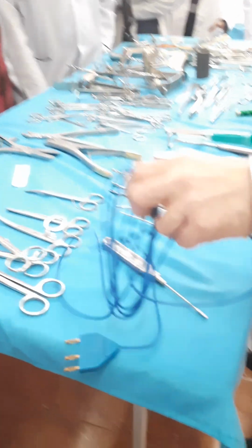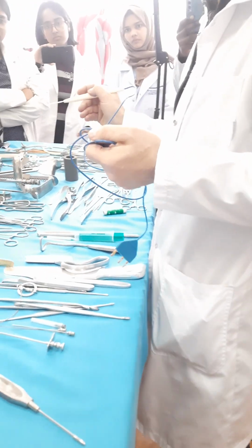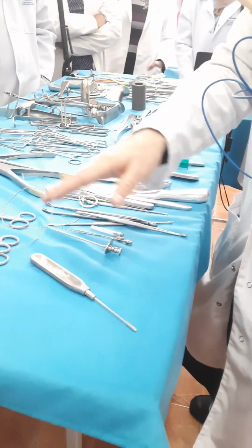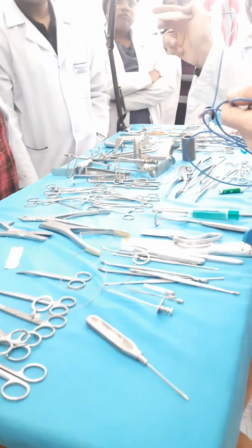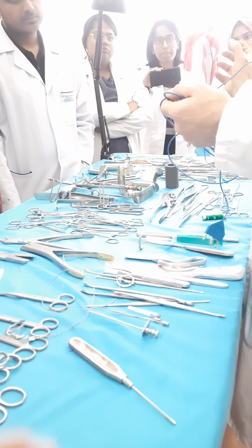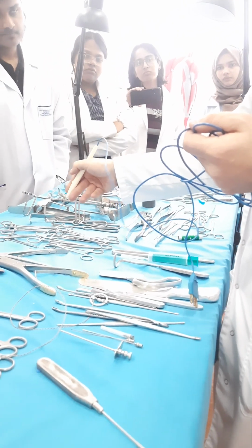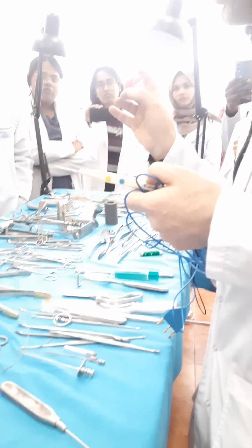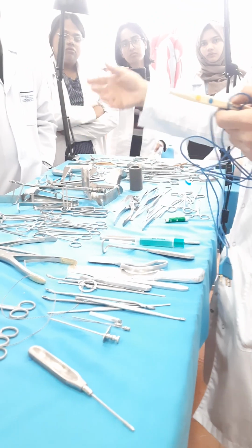That is about the electrical scalpel, or we call it electrocoagulator. It has two functions, by the way, cutting and coagulation. It is included in both groups, first and second. In both groups, I can cut the tissues except the skin. It's forbidden to cut the skin because it will make ugly burning scars. All other layers I can cut, or I can coagulate small vessels. It's forbidden to coagulate middle or big vessels because we will have secondary bleeding. Pressure will increase, the thrombus will be cleared, and we will have more bleeding.